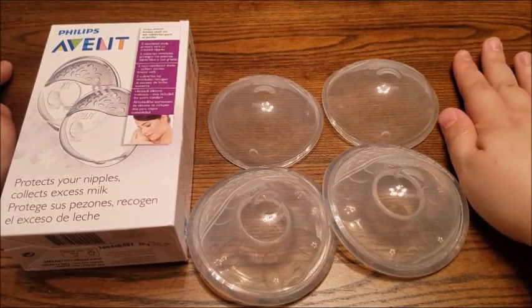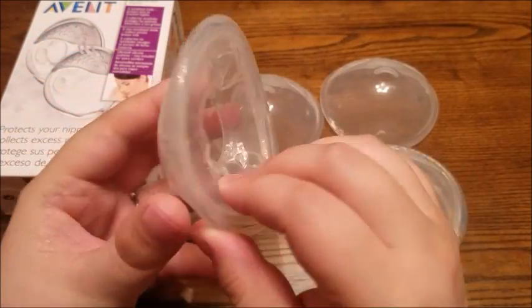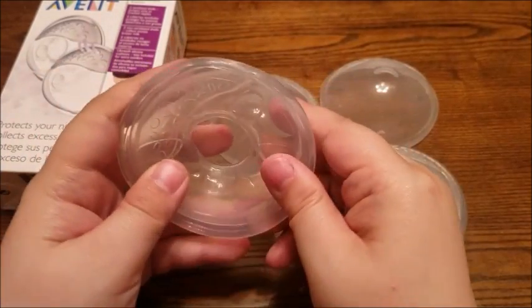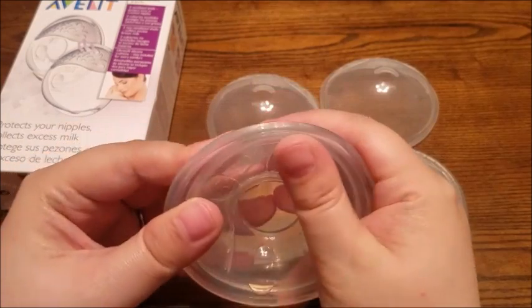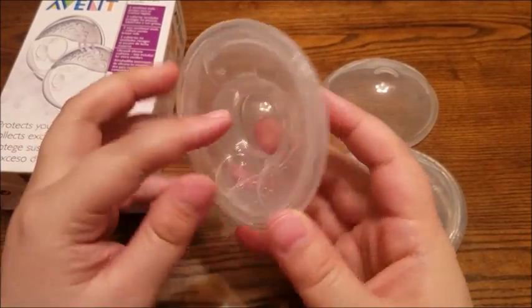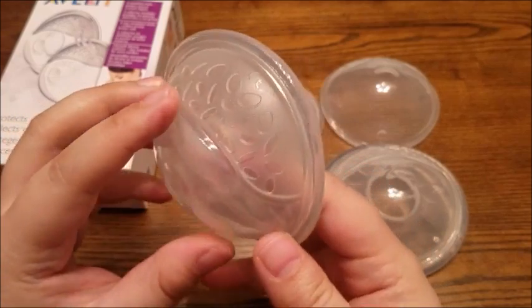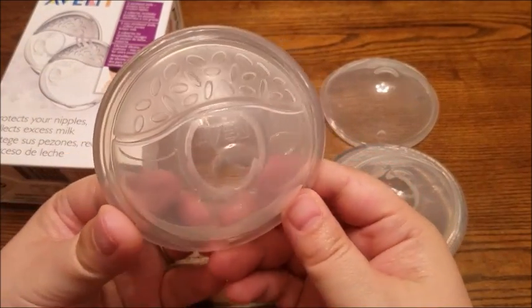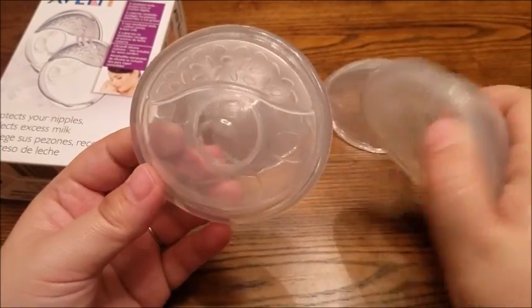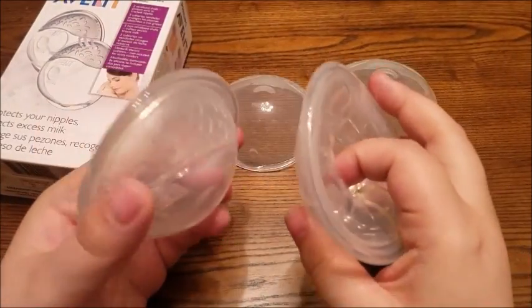I used them all week long and they were awesome. I actually used the non-vented ones the most — this is how they look. They did exactly what they're supposed to do. They collected milk and I didn't spill any, not with these ones. The only thing I would say about the non-vented ones is if you're going to wear them for more than half an hour, they tend to get a little sweaty because there are no vents. But they did a really good job collecting all the milk. I collected about half an ounce each side, which adds up. For an hour, it really adds up — so that was pretty good.